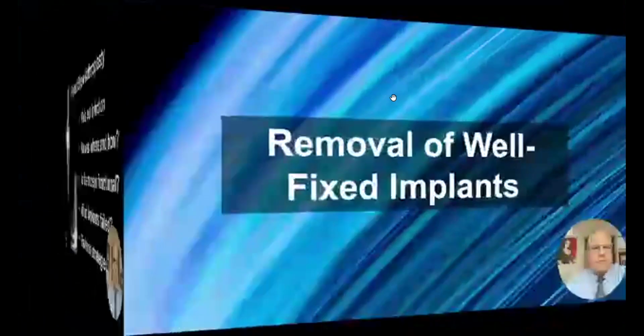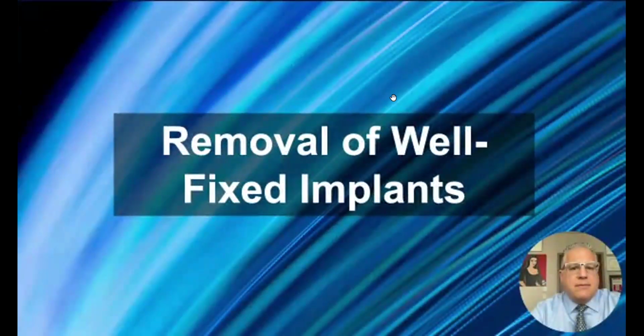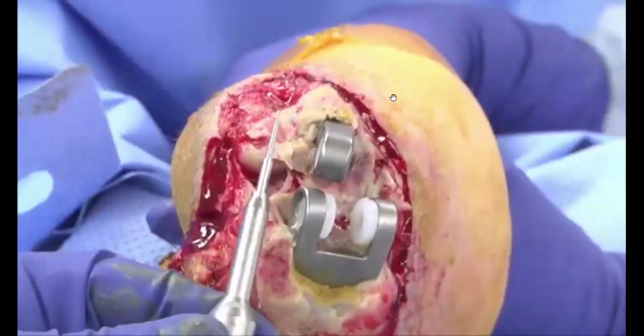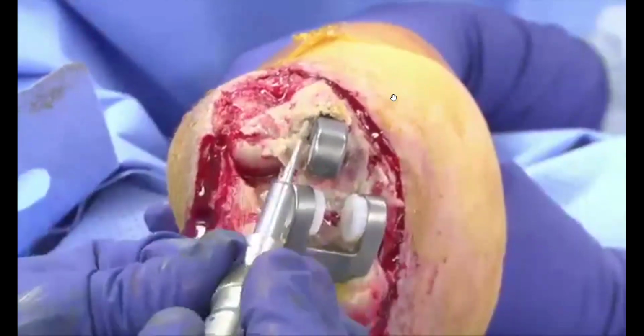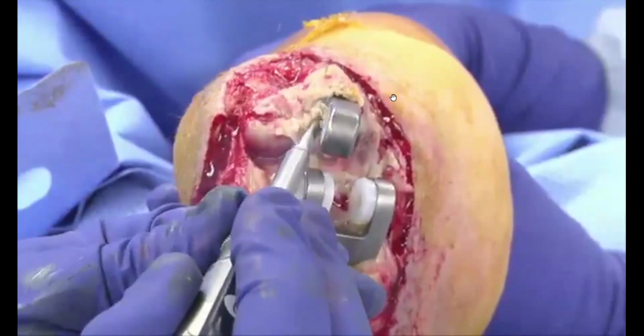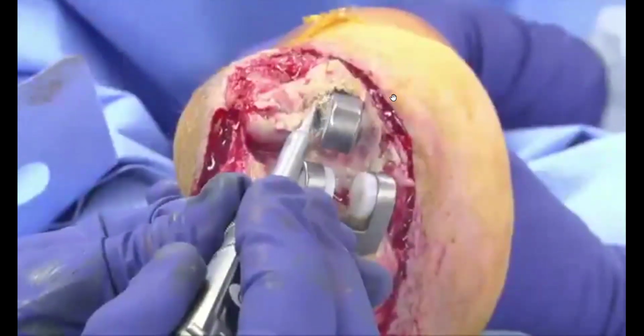One challenge sometimes is removal of well-fixed implants. Our workhorse is the use of a pencil tip burr that allows careful debonding of the implant, cement and bone interface before safe component removal.